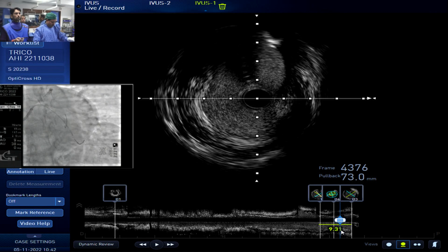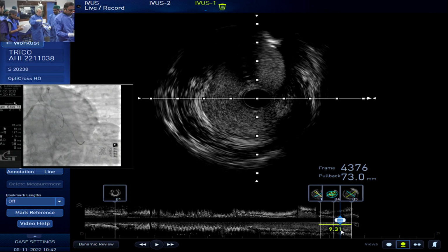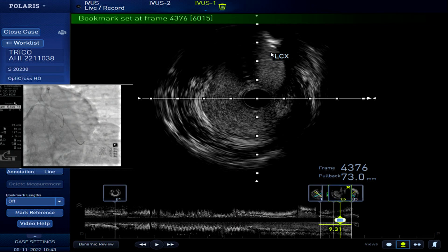And that is the beauty, I think. That is also a reason why sometimes it's very interesting to do this kind of imaging, because angiographically you could have thought that an ostial stenting was possible, and just doing imaging you understand indeed that what we see on angiography is sometimes eluding. Yes, I agree.